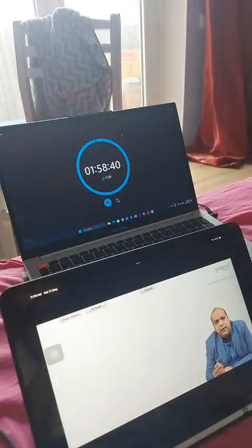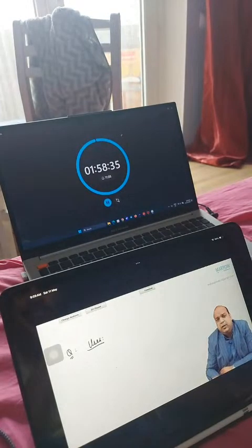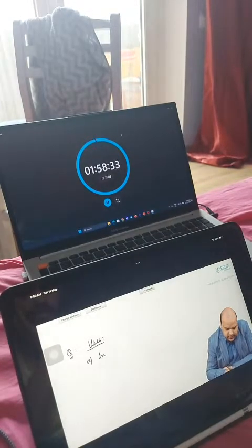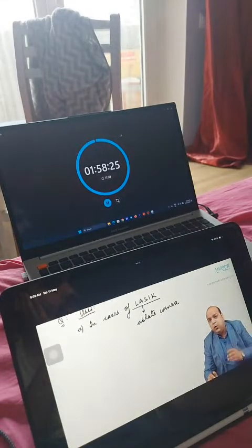When do we do pachymetry? Why are we doing pachymetry? That is the question. So, uses, I can say. Why are we measuring the corneal thickness? Number one, in cases of LASIK. When we need to do LASIK, we need to ablate the cornea. Ablate means we are burning the cornea, so we are making the cornea thinner.